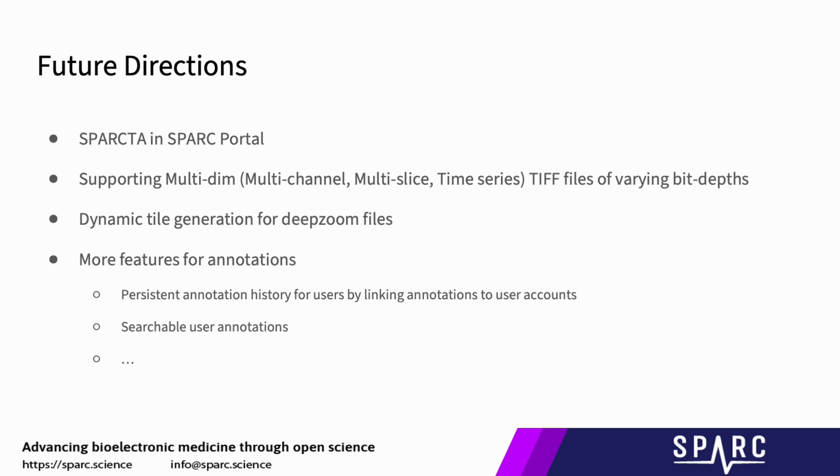We also want to change the tile generation from static to dynamic for deep zoom files. And for annotation, we want to add more features, for example allowing users to make their annotations public so more people can see them, which will definitely offer more collaboration in the future.